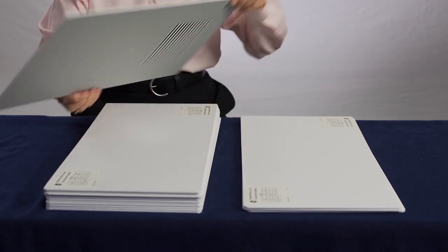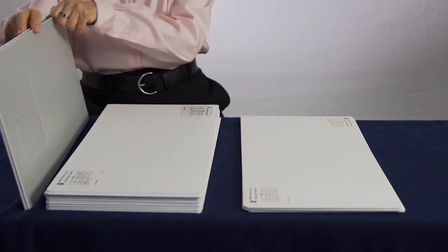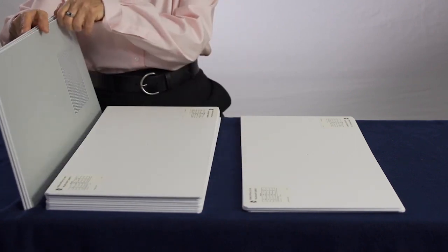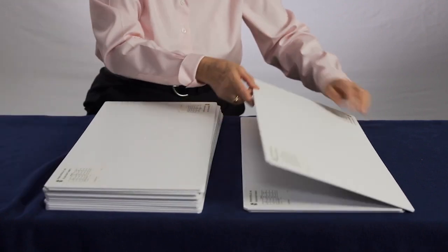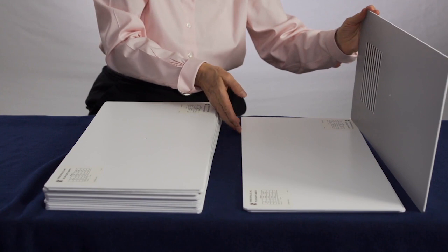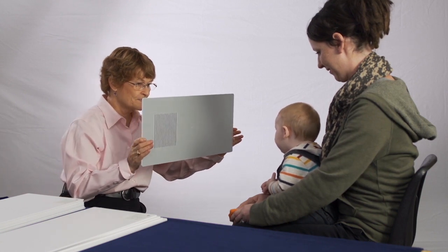The not seen stack has the start card topmost with progressively finer gratings in series below the top card. The seen stack has the gratings that are coarser than the start card in a series of progressively wider stripes below the top card. The examiner picks up the top card from the not seen stack and tests the infant with this grating. If she judges the infant detects the grating, she places it on the seen stack.